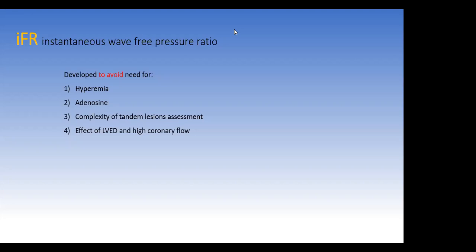Yeah, no, thanks. I agree. And I think obviously it is very user dependent, both at the end user level and at the upstream interventionalist level. We discussed this at Journal Club a couple of iterations ago, but is there data to suggest that, at least in the coronary bypass grafting world, FFR or iFR guided bypass surgery is as effective in determining long-term graft patency versus simply leaving it to your angiographic interpretation? So there are several trials, and we discussed it as you indicated.